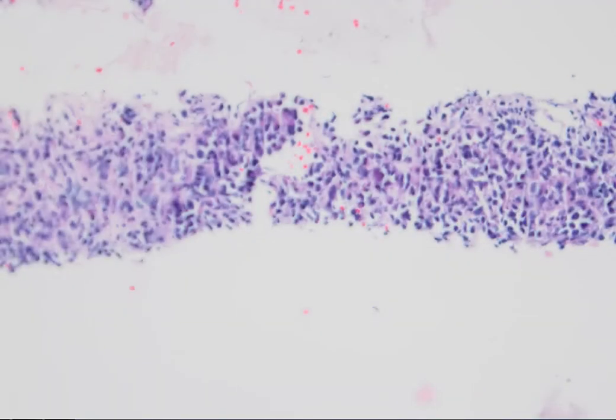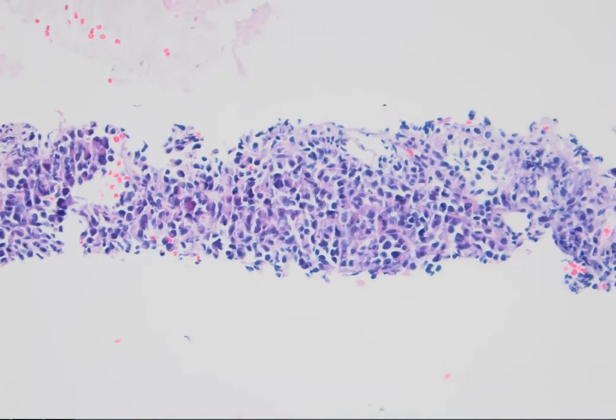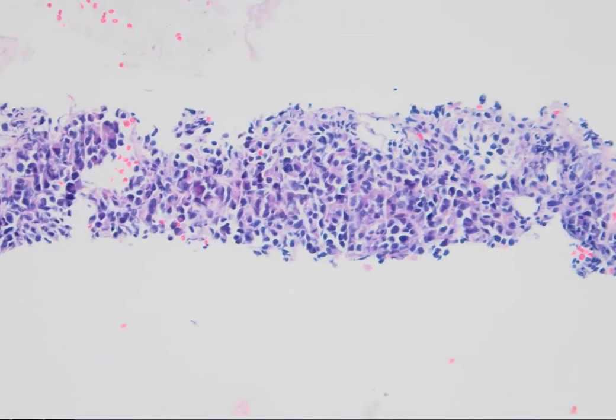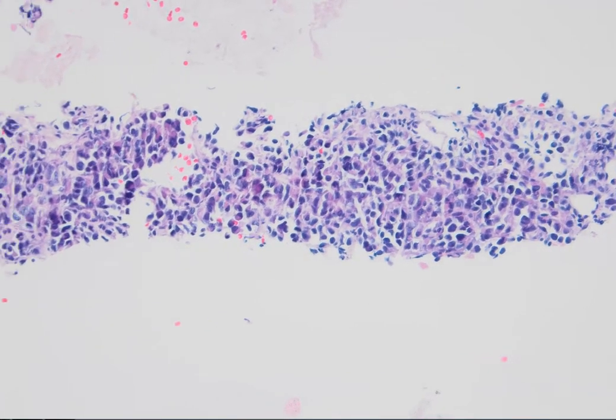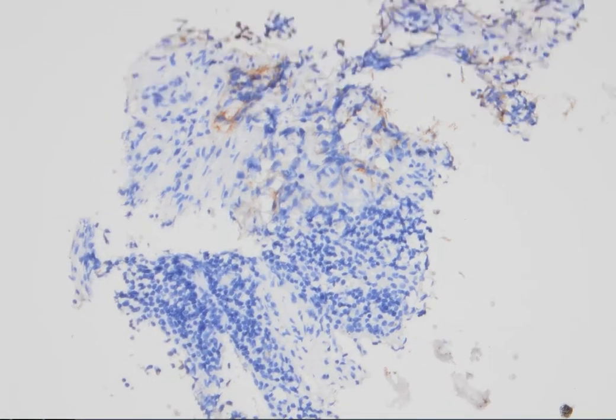It seems to be an ugly tumor with lots of pleomorphism and hyperchromasia, and in the outside center it was synaptophysin positive.